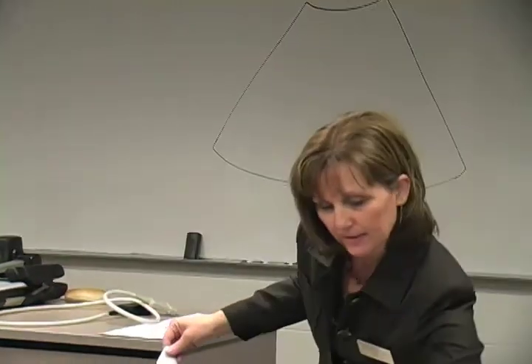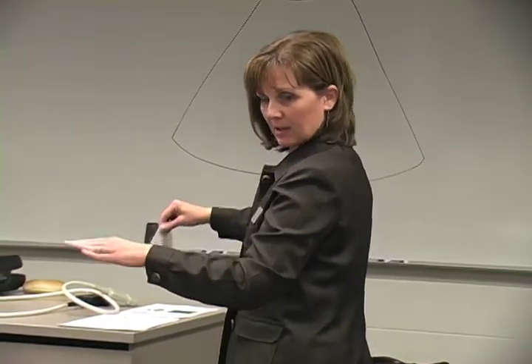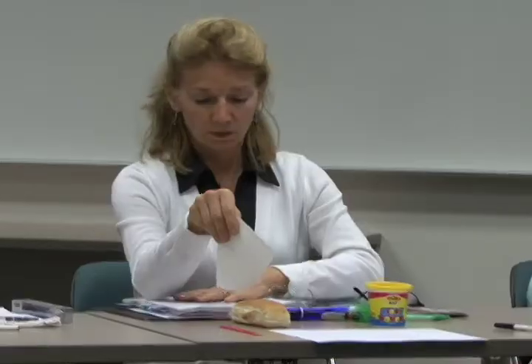Okay, so now your hand is going to be the transducer, and the coffee filter, if you want to lift that up. These are the sound waves that are coming out of your transducer. Okay? So the notch is going to be your thumb. Okay? So you're going to place the patient over here to your right because our machine is to the left. So when the notch is towards you, you're in what plane? Transverse. Now turn the notch towards the patient's head, and you are in sagittal.